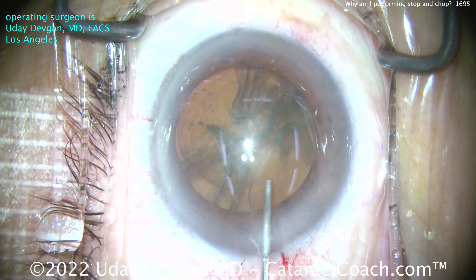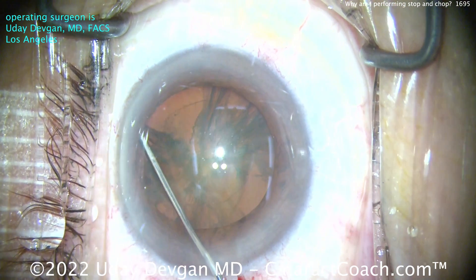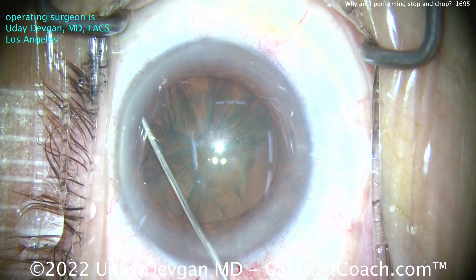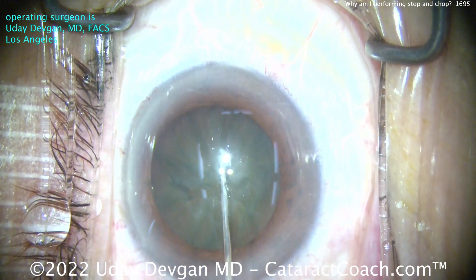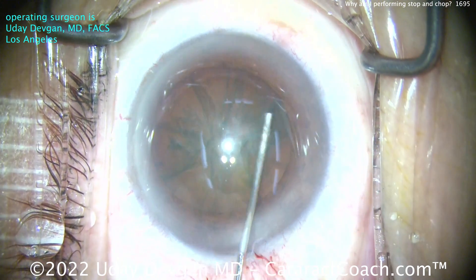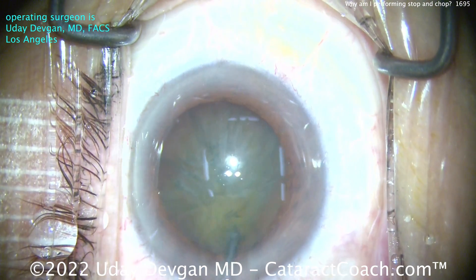You've taken away a lot of the bulk from that central dense endonucleus. And so in a case like this, where it's a hyperopic eye, a big nucleus, a shallow anterior chamber, it gives you a little more working room. So there is an advantage there.